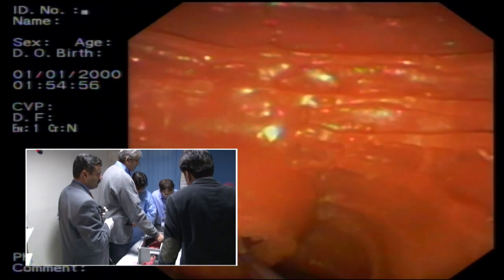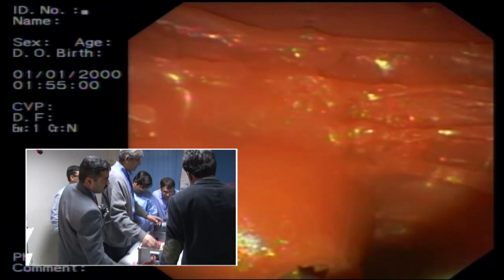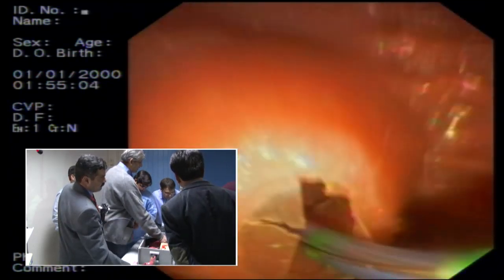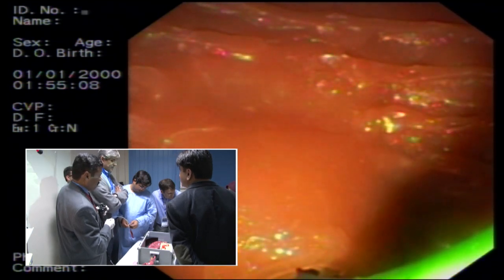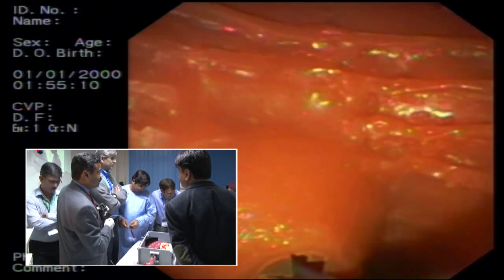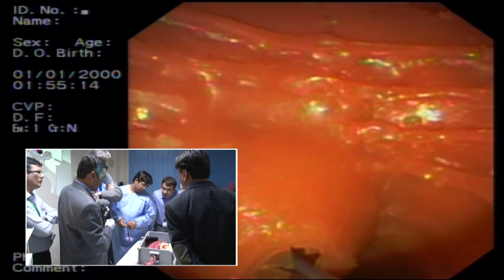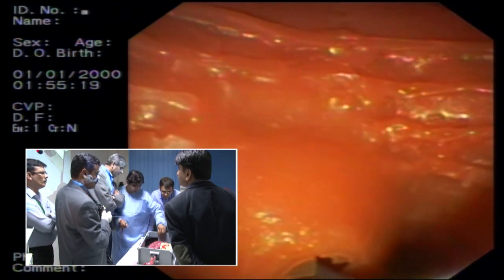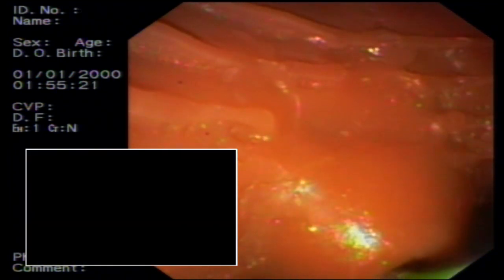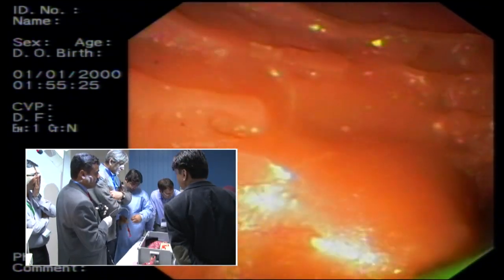ठीक है Shahid, you maintain your position. The way you maintain your position is I think you can still manipulate this one a little bit. Now I think that's pretty good. जब आप इसको push करो, wire डालो अपना. Just put the wire. इसको डायरेक्शन चेंज करनी पड़ेगी. इसको निकाल के इसको आप विड्रॉ करें.